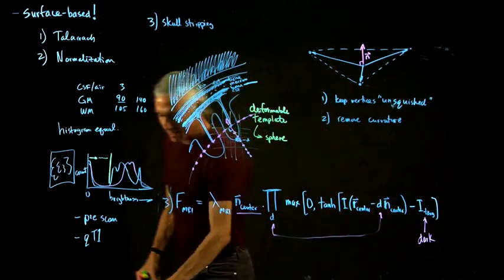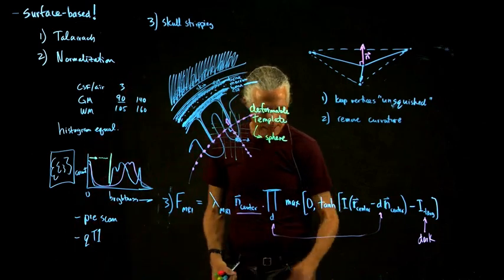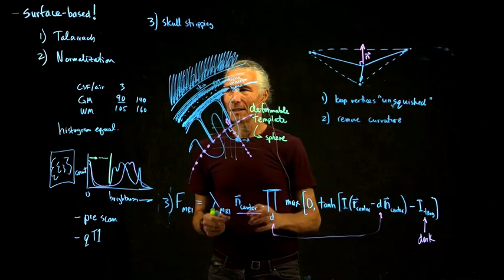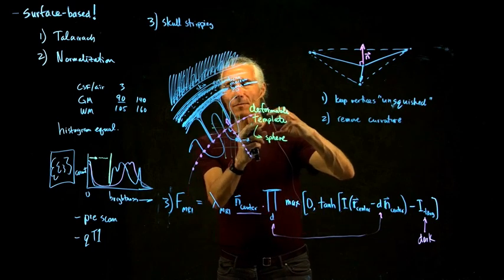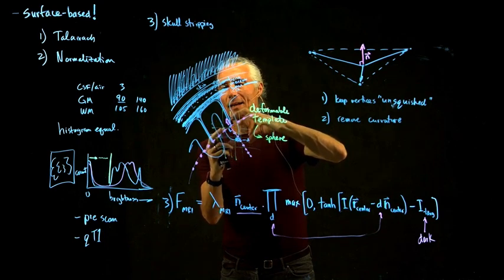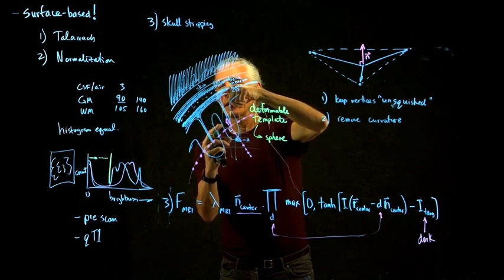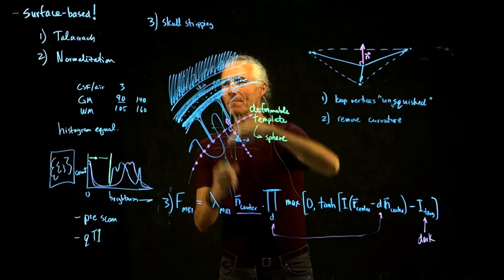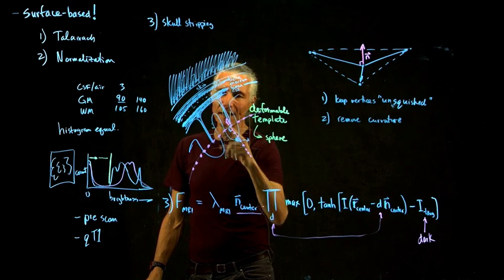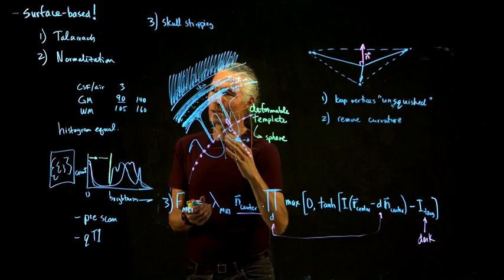So this is how these programs actually work. Computers are fast now, so they can do this all in just a couple of seconds. But that's kind of the guts of how it works. You start off with a deformable template, a movable template, and then you plop it in the middle of the brain and allow it to expand outward by doing all these core samples until it finally hits some black, and then as soon as it hits some black, it completely stops. The reason you have to do extra core samples is in case there's black inside the brain. We have to skip that, and some of the other core samples will help push it out.